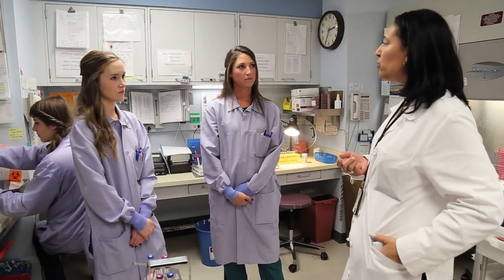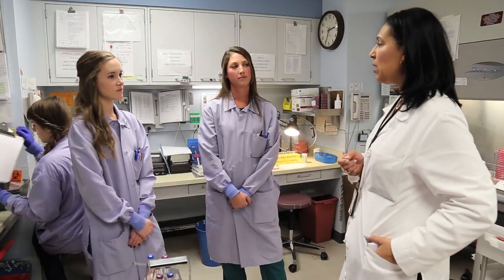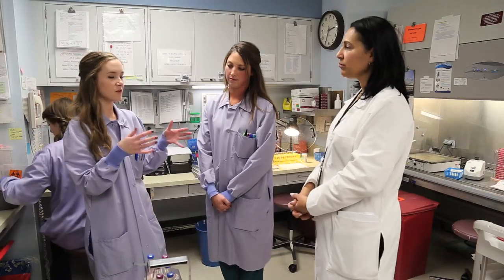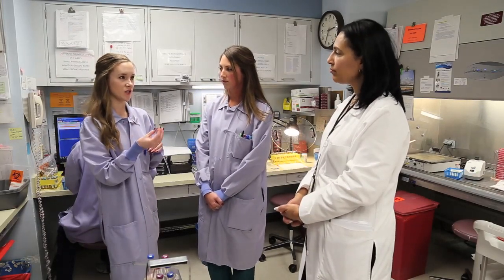Let's see, any other issues with any specimens? Let's say biopsies or tissue specimens. Yeah, so with tissues and fluids, it's always best, if you want a culture done on it, to get the actual tissue and the actual fluid. It's not good for us when we get it on a swab. It's not holding enough of the actual sample. So if at all possible, we always want the fluid or the tissue.